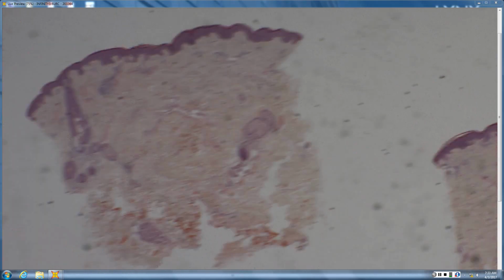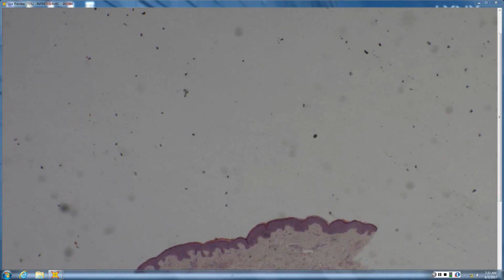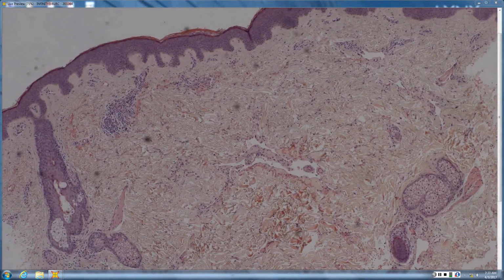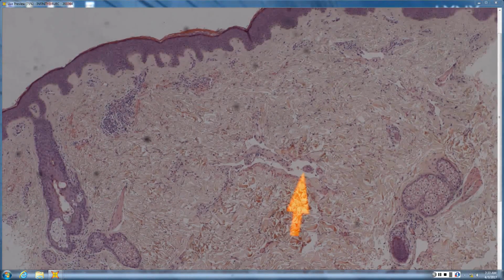So, Shane, you want to start us off with what you see here? Looks like there's a central vessel. So there's one there and there's one here. So describe what you see there. There's no real hobnailing. The center looks like a floating vascular space there. And what's kind of sitting right in the middle there? What's this?